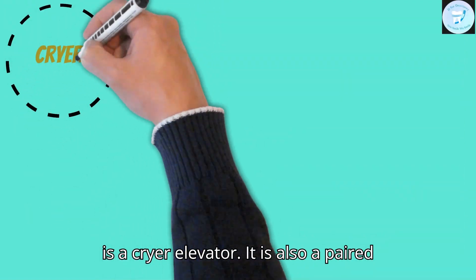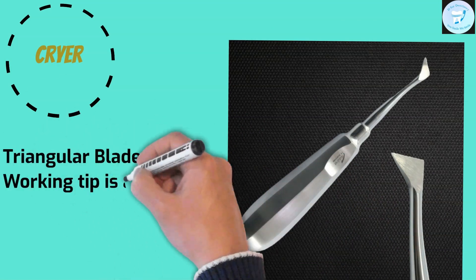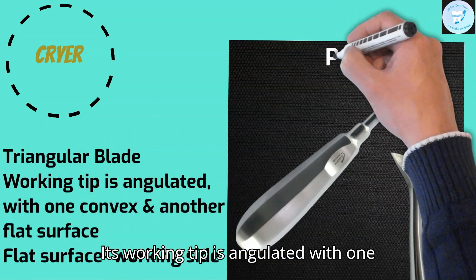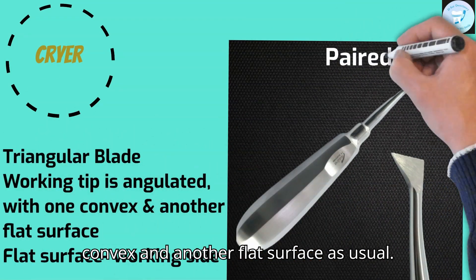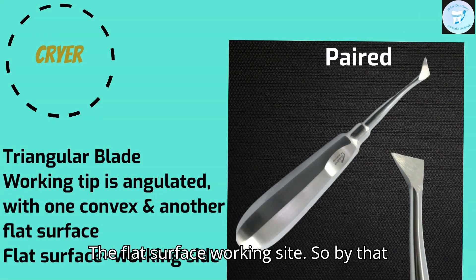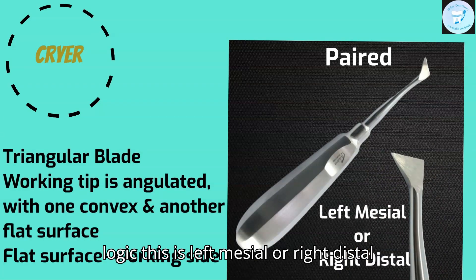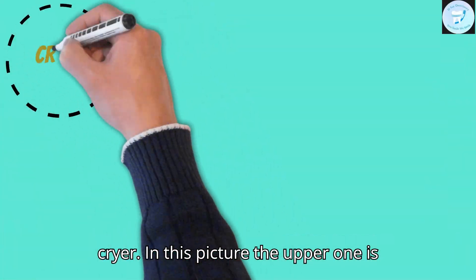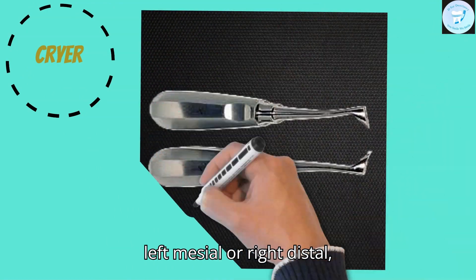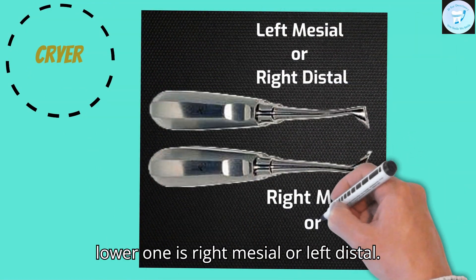This is a Cryer elevator. It is also a paired instrument. It has a triangular blade. Its working tip is angulated with one convex and another flat surface. The flat surface is the working side. So by that logic, this is the left mesial or right distal Cryer. In this picture, the upper one is left mesial or right distal, and the lower one is right mesial or left distal.